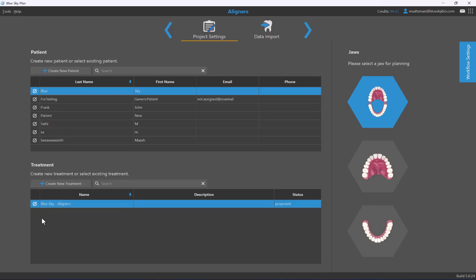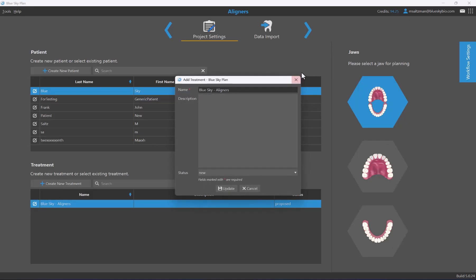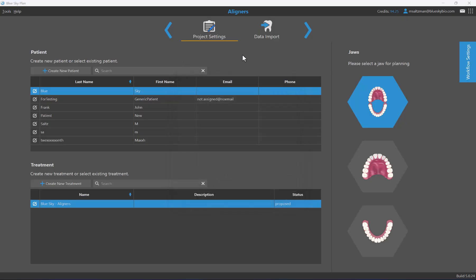Going back to our patient Sky Blue, we can see that a treatment name has been automatically created based on the patient's name and treatment. You can leave it as-is or modify it using the edit option. On the right side of the screen, you select the relevant jaw — for aligners, both jaws are selected by default, but you can change this as needed.